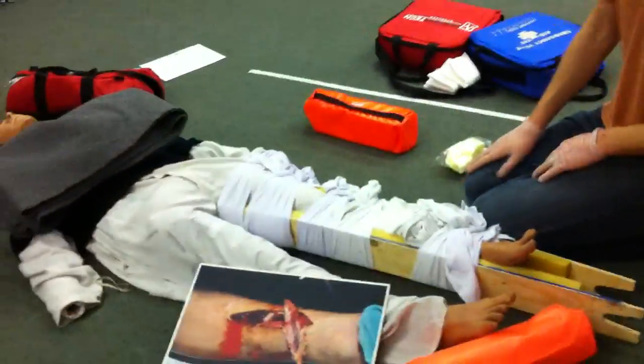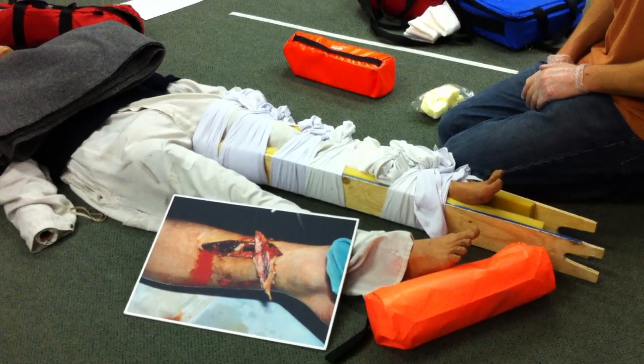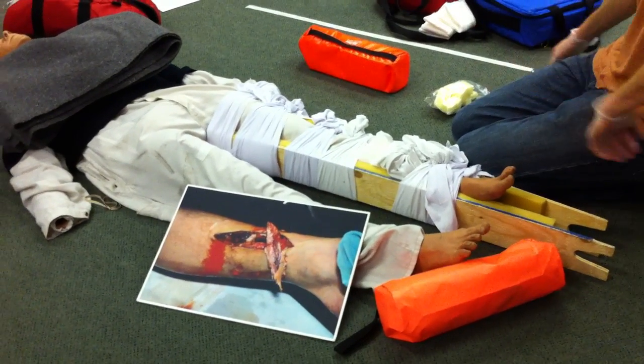Can you do that? Yeah. I've been looking at it to see which way I can twist it. Great. Okay, thanks.